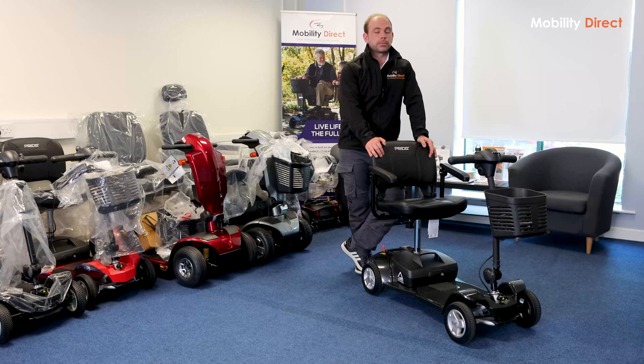Hey folks, Martin here from Mobility Direct. Hope you're well. In this video, I'm going to be reviewing the new ultralight scooter from Pride Mobility, the Pride Apex Alumilite.